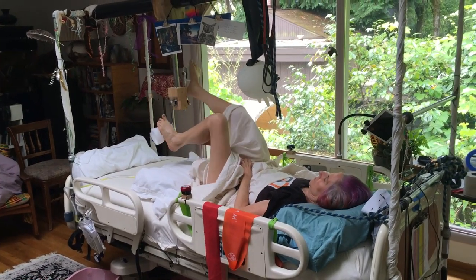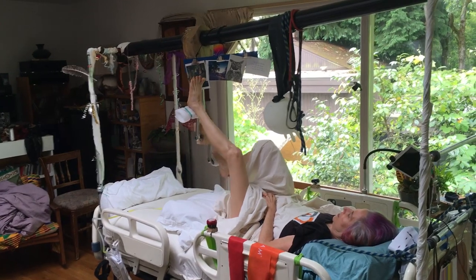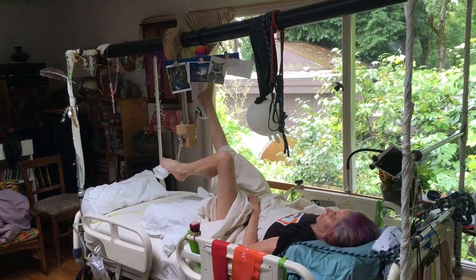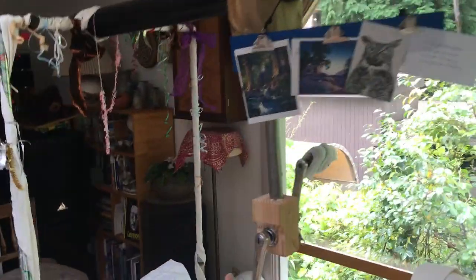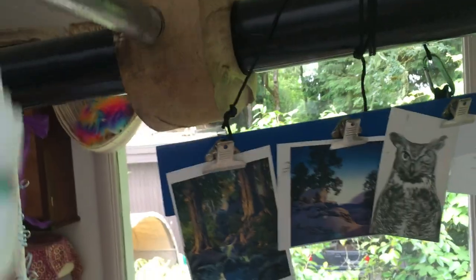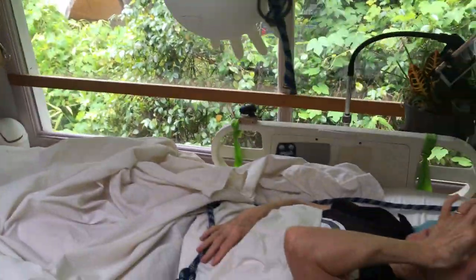She can do lots of stretches on these too. Lori can show a classic stretch she'll do on the pedal system. The pedals can also be moved in lots of different ways — I can just slide them off to the side. If you want the pedals out of the way, you simply put it up like that and friction holds it, giving better access to the patient. And we've found that's plenty of friction to keep it right where it needs to be.